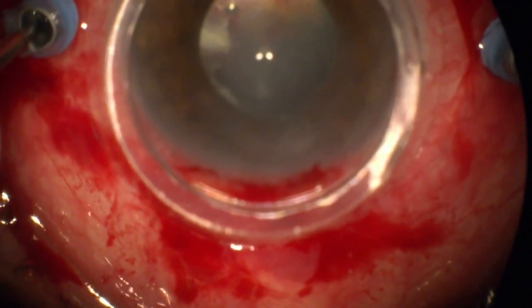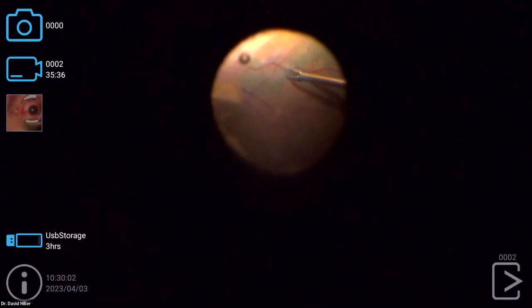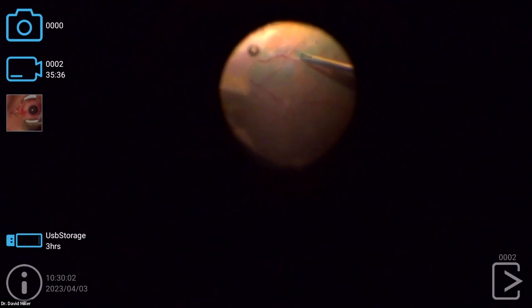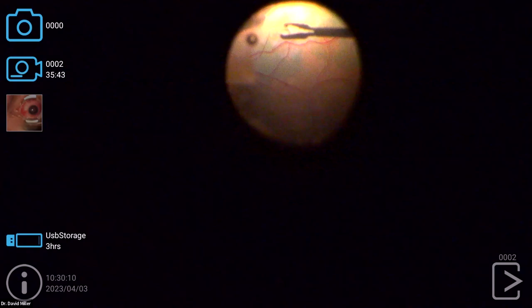The patient did have a prior macular hole during one of his retinal detachments that was closed under the oil, but closed and scarred. Different things too. So here we go. I know we're probably off the screen at times. I apologize, more complex case.